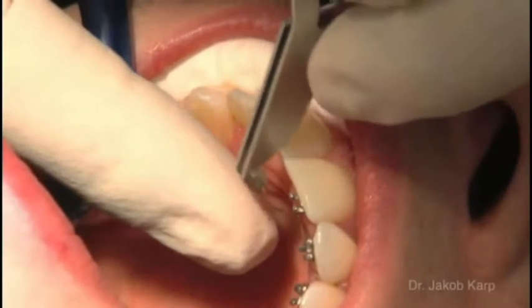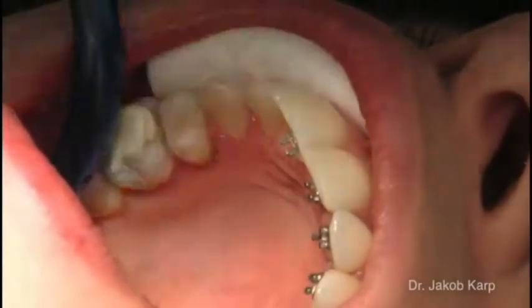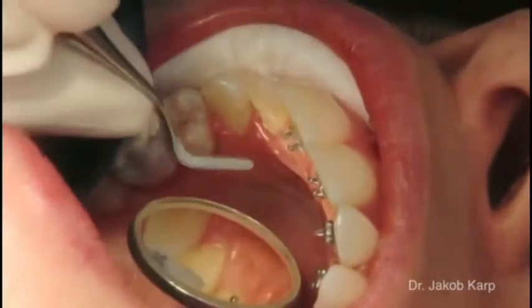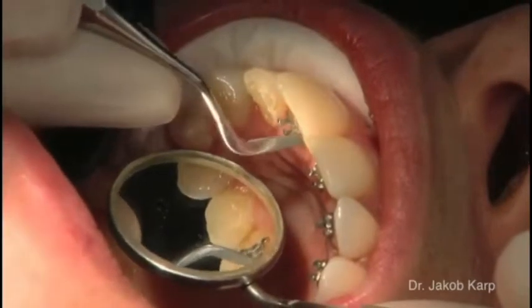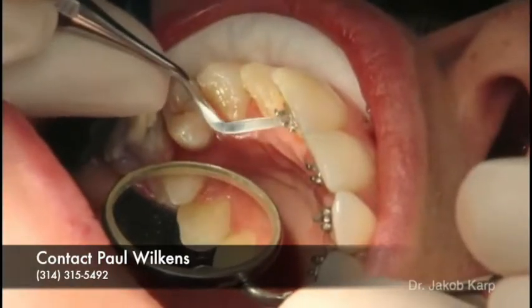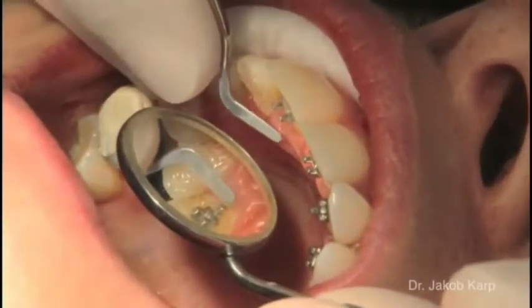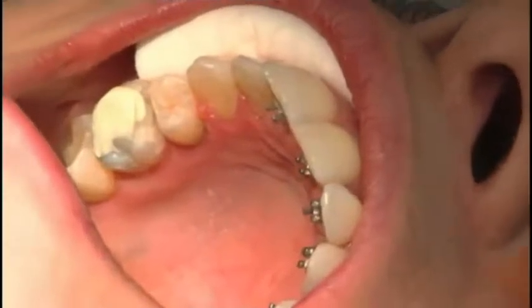In simpler cases, the 2D lingual brackets can be bonded directly without requiring any laboratory work. Depending on the experience of the dental professional, this can be performed without previous marking. To remove any possible contamination, the bracket bases should be cleaned thoroughly with acetone prior to bonding. The composite coated brackets are bonded consecutively to the prepared teeth and their position corrected using a scaler. Then the adhesive is light cured.